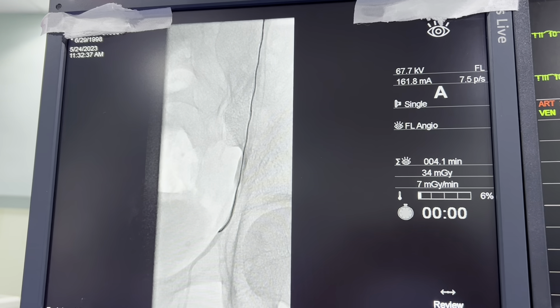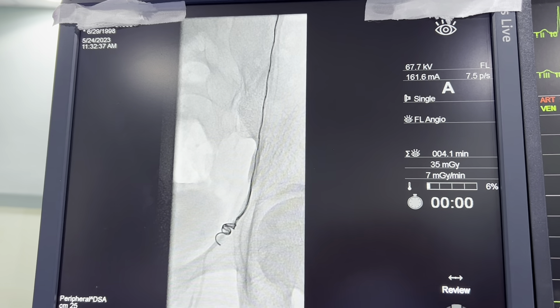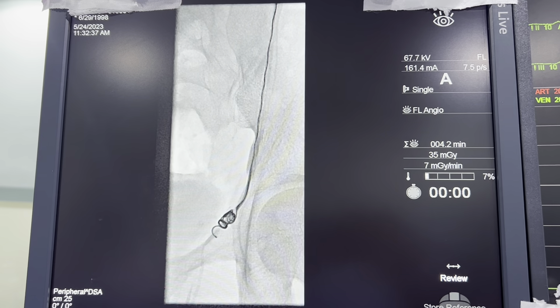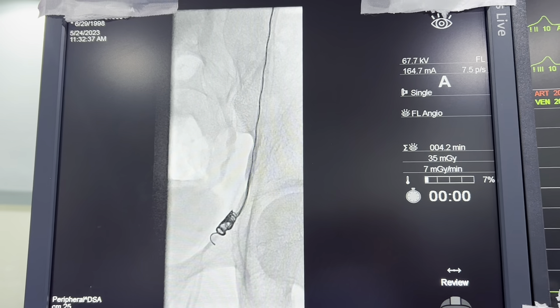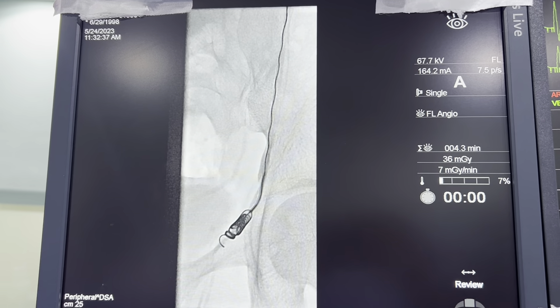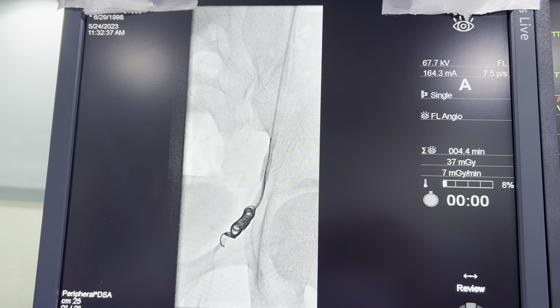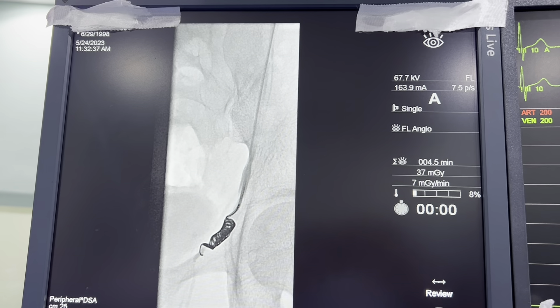We're about to place the first coil. You can see that coil — we try to make sure that it doesn't go below the inguinal crease. That's the metal coil coming out, that ball you see there. You can see this is being placed perfectly above the inguinal crease. Once we place the first coil, then we start to place the gel foam and the sclerosing material to ensure this vein stays completely closed when we're done.